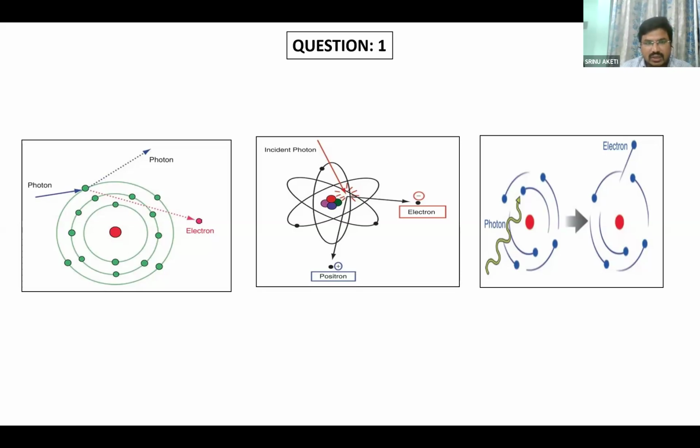Can you repeat? Yeah. So we can do treatment planning only on CT images because CT images contain electron density information. Really, it does not contain an electron density file, but there is a relation between CT number and electron density, which we input in the TPS. While importing an image, we apply the CT to electron density conversion file, so that it converts the HU values into electron density values and I can do the planning, because Compton scattering is the more predominant in the treatment delivery. So I have to do planning on an image set which contains electron density. Only CT images can contain electron density information, so we cannot do planning on MRI, ultrasound or X-ray.